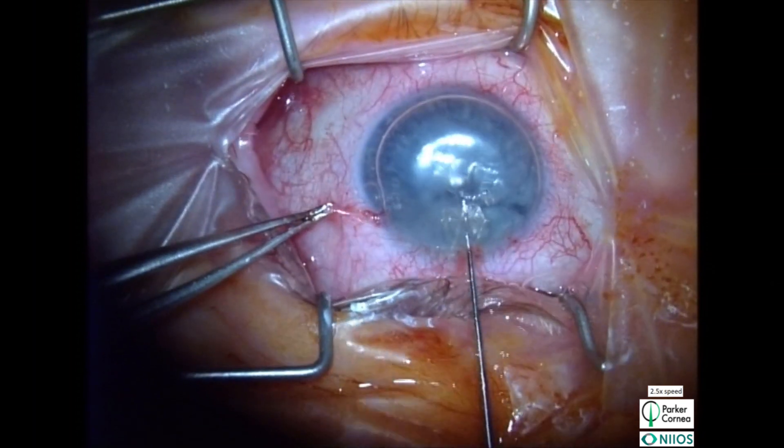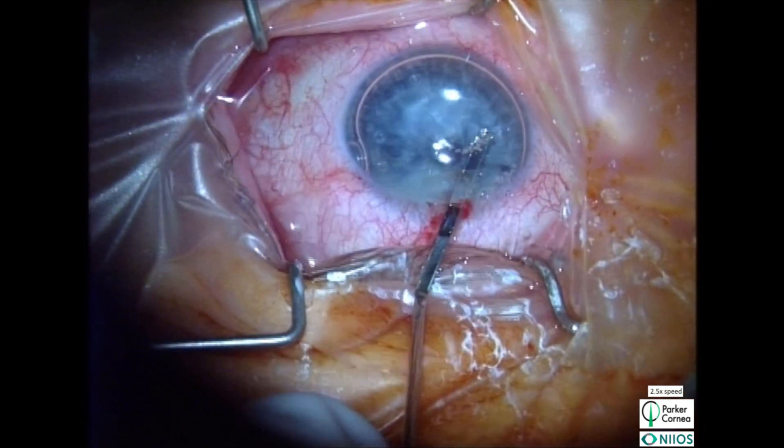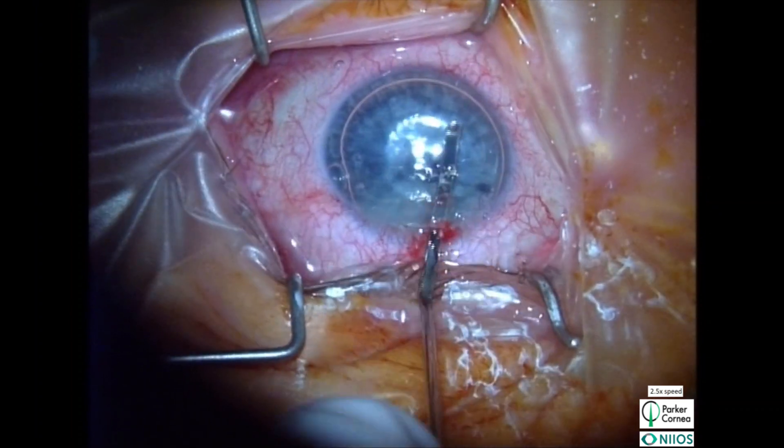Be sure to remove all endothelial and Descemet membrane remnants to promote graft adherence, considering that the rate of graft detachment is noted to be higher in quarter DMEK.